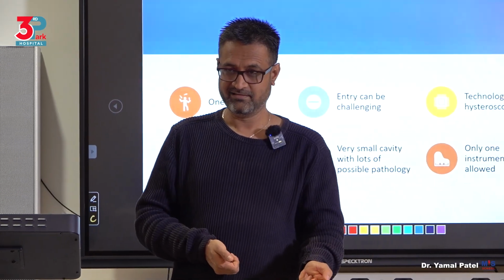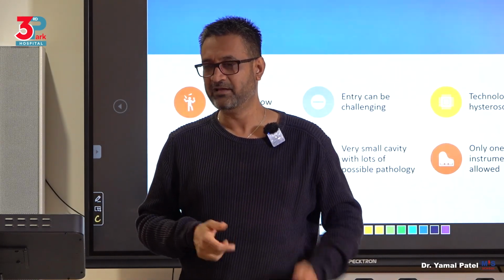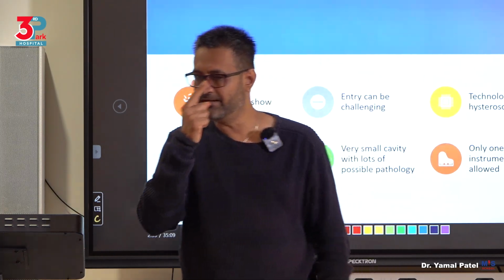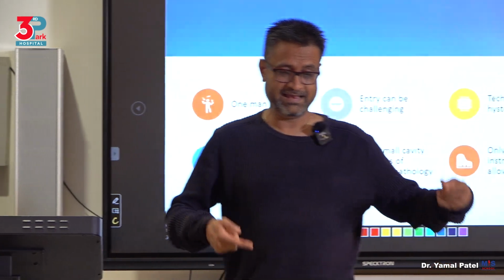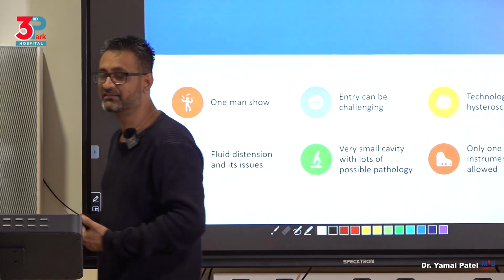Surgery in open surgery is two-handed. But surgery in hysteroscopy is one-handed. Yes, I'm still using two hands, but what I meant was one is my view and only one is my operating instrument. That's what I meant by one hand. I'm still doing it with two hands, but my operating instrument can be handled with one hand. You've understood what I'm saying? I can't have my assistant hold the camera and I go in with two instruments. It's a bit difficult. One, there's no space in there, and two, it's cumbersome to have two instruments in there.